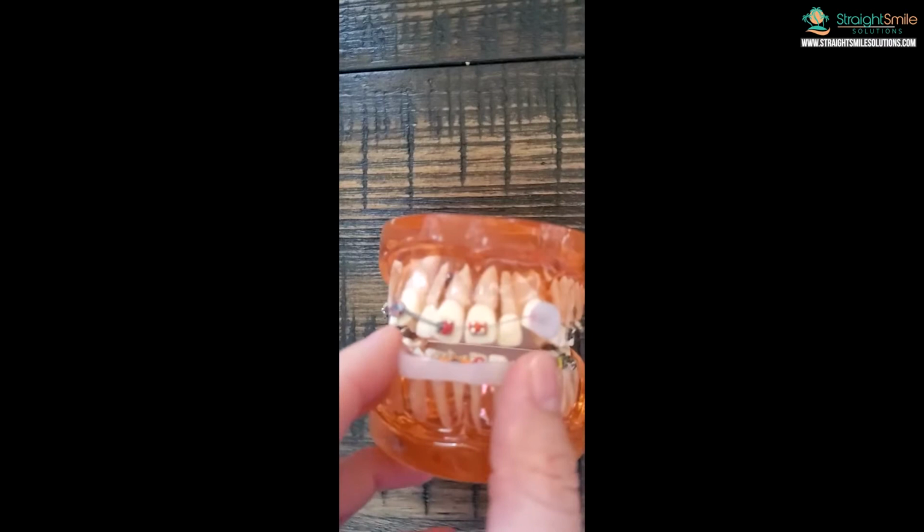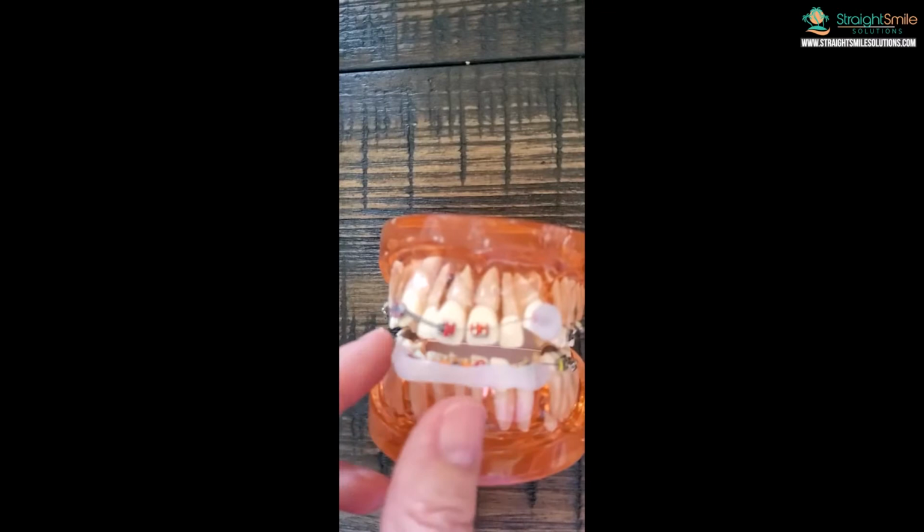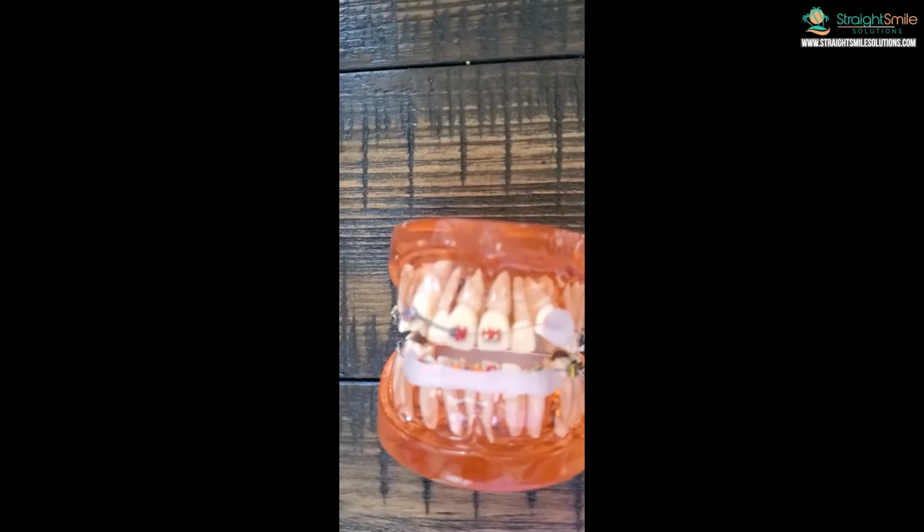So if I were a parent, I would buy many of these before you even start. You're probably going to get one from your orthodontist. You're going to need way more. And these are only like $2 a pack, so just buy them in bulk, okay? All right, so that's wax. Wax is your friend. You can never use too much, and you'll probably be done with the wax in a few weeks. You'll get used to it.